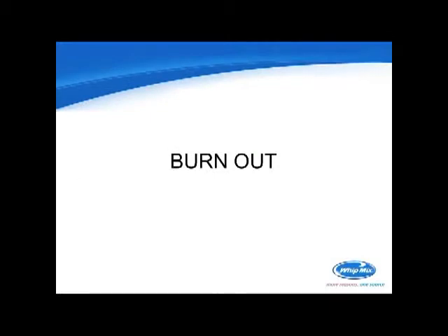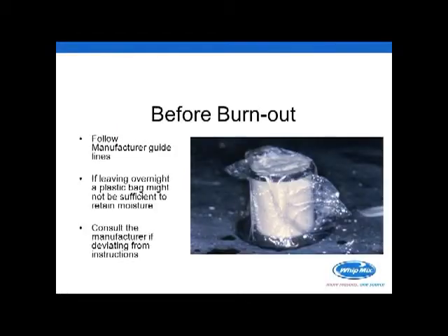All right, burnout procedures. Before you burn out, you want to follow the manufacturer's guidelines. If you decide that you're going to change your burnout procedure, or you've been doing it a certain way forever but you're having problems, it might be that you need to go back to the manufacturer's recommendation. If you're going to leave it overnight, a plastic bag might not be sufficient to retain the moisture, and in many cases it's just not even important anymore. I know a lot of us have done that. Why? Well, we did it years ago. But many of the new modern investments just don't need this to be part of the equation here.